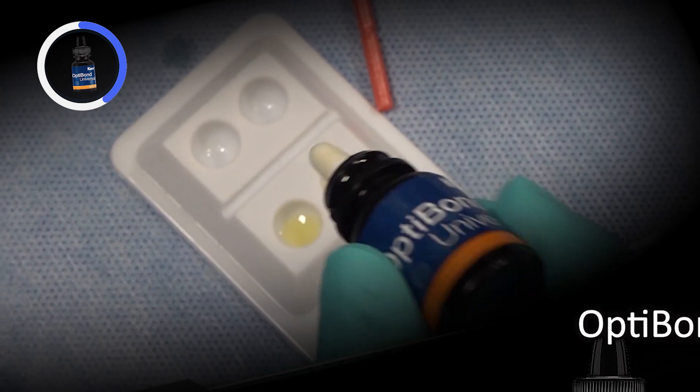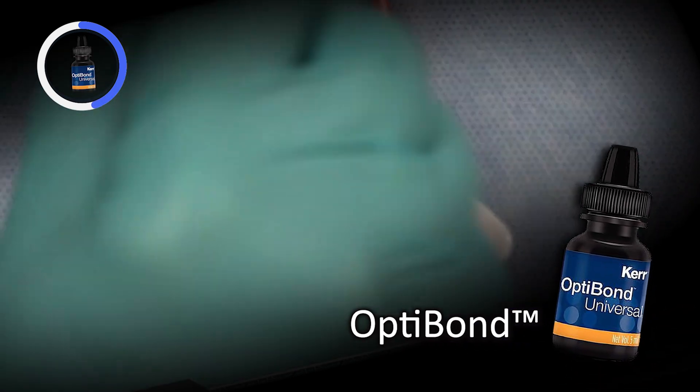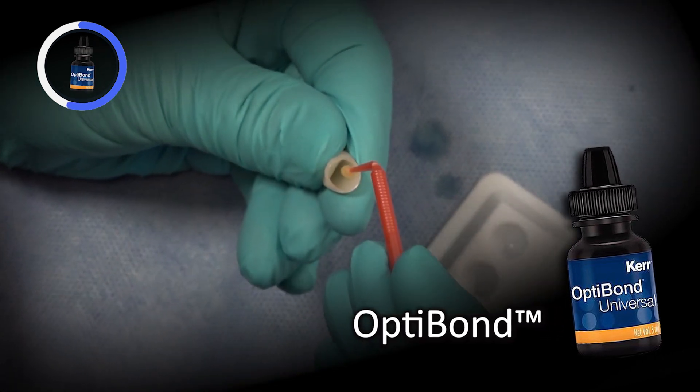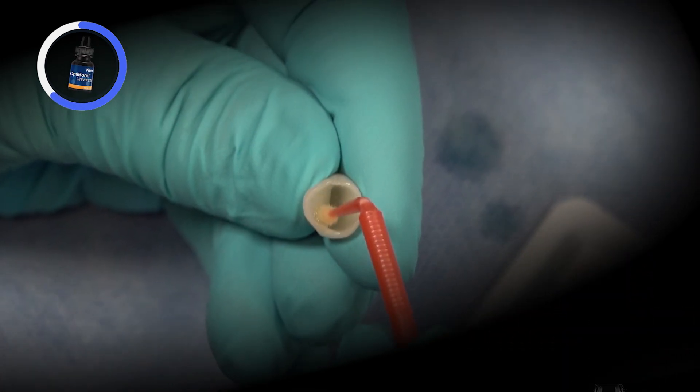We then apply a very thin coat of OptiBond Universal inside the restorations to act as a primer for the zirconia. Once the restorations are cleaned and primed, I begin prepping the teeth for bonding.